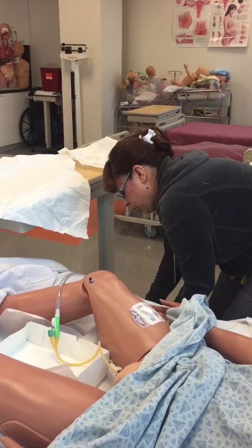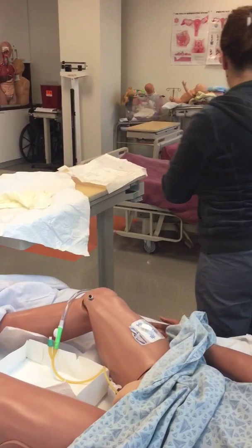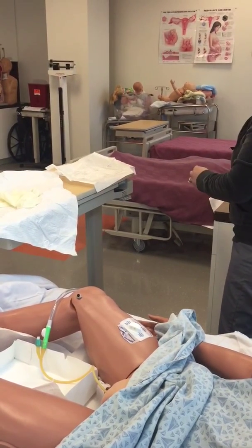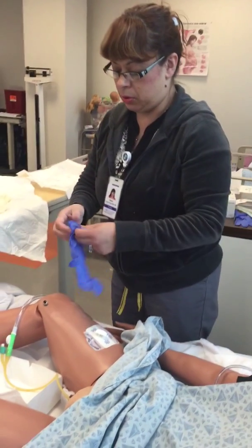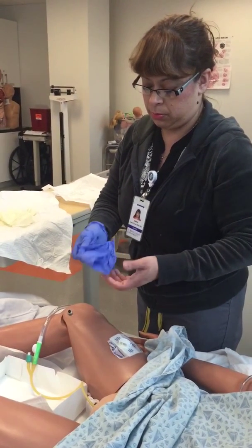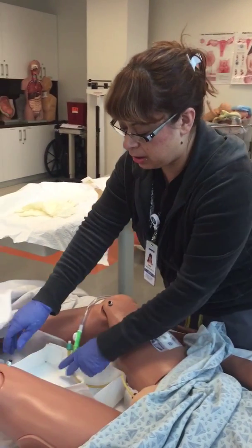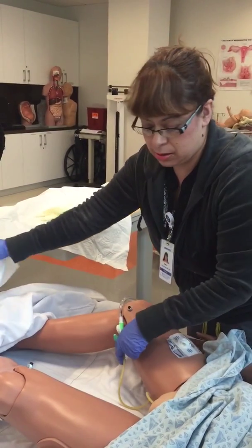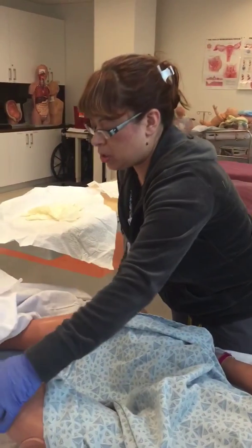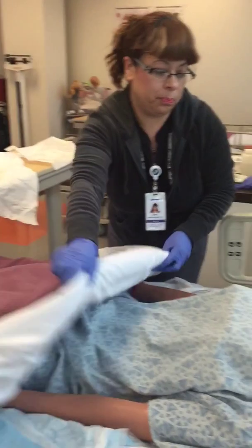So at this point, when you're doing your cleanup, you can take your set of gloves off, wash hands, put on another set of gloves, and clean up all of your stuff. Because I have betadine in my hand, I don't want to put betadine everywhere. So get rid of this. Position your patient for comfort. Get them nice and cozy.